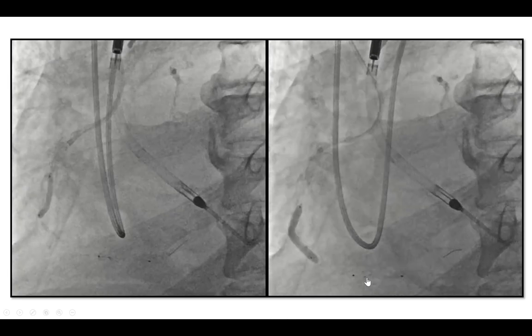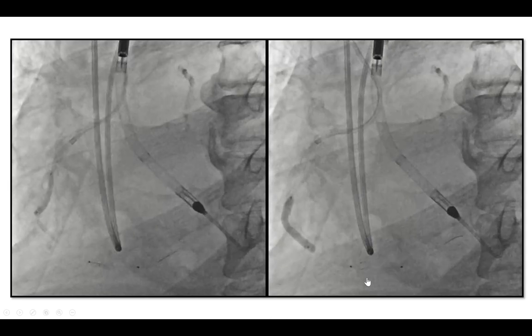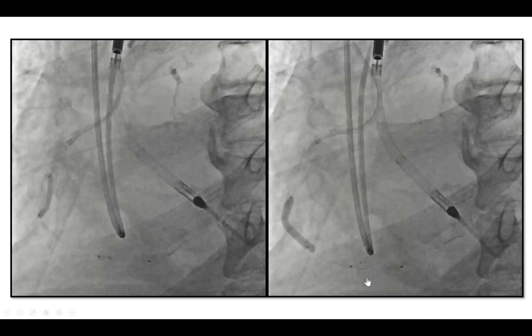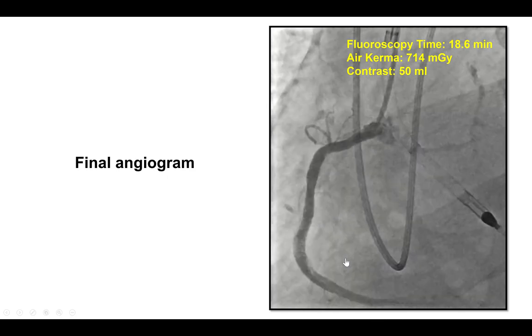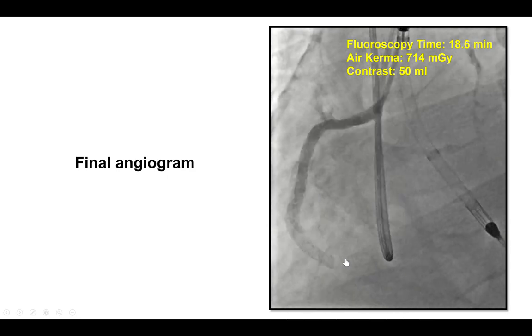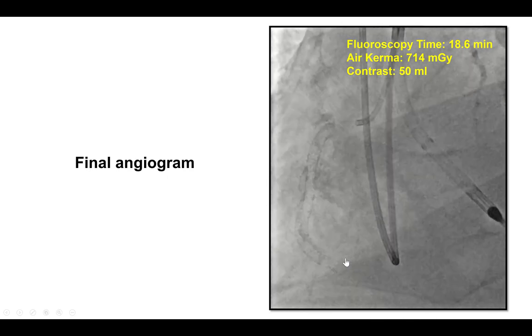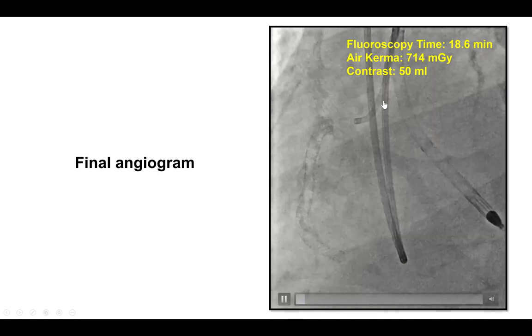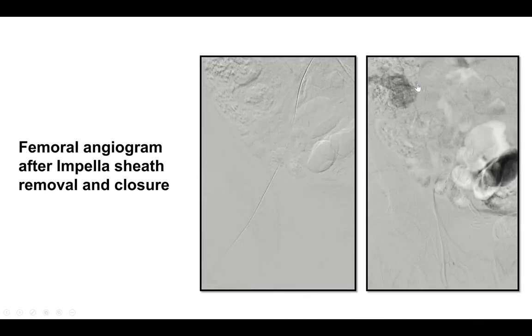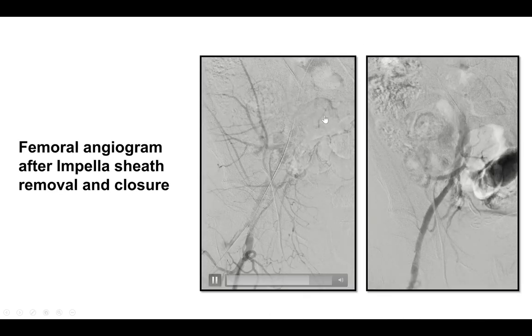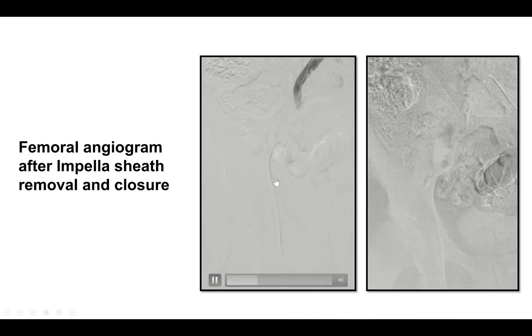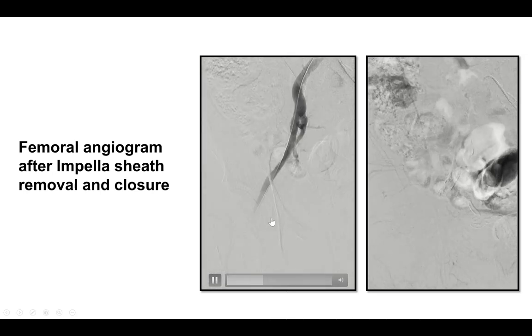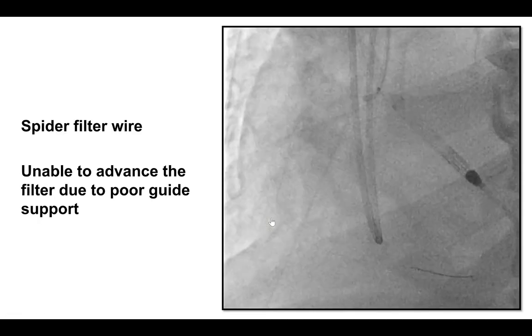The rest of the procedure was uneventful. We considered doing prophylactic atherectomy, but we decided to first start with balloon angioplasty because of the presence of intraluminal thrombus, and there was good balloon expansion. That resulted in a successful result after stenting of the lesion with drug-eluting stents and no distal embolization, with a small amount of thrombus retrieved in the filter. 50 mLs of contrast were used and the patient did not have any worsening of renal function. We closed the pre-closure sutures which had been placed at the beginning, resulting in good hemostasis and preserved antegrade flow. Therefore, there was no need for any additional intervention on the right common femoral artery.